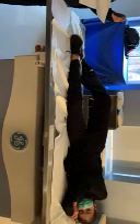Okay, so for the pelvis, which we're about to get to, the pelvis is going to be very similar to the abdomen. Right? When we were doing the abdomen, you could shield males, but you couldn't really shield females, because abdomen, pelvis, they're both bilateral. You're getting both sides at once. Exams like these, they are unilateral. You're only going to see one side at a time. So you can shield the other side.